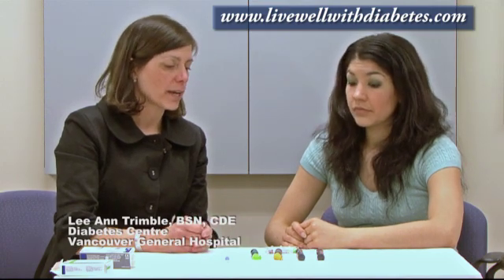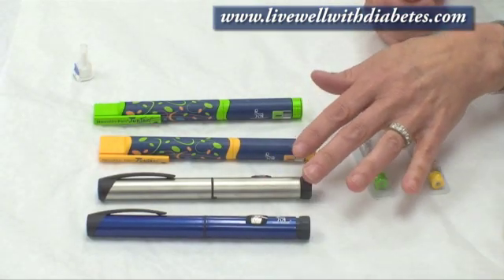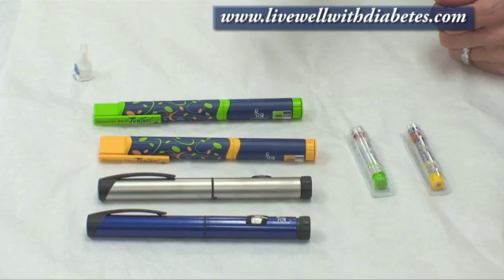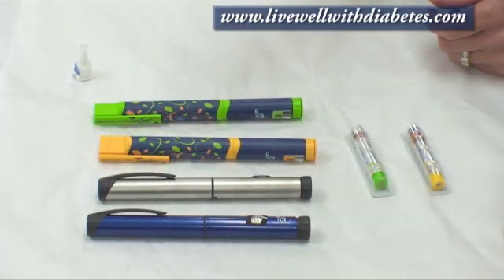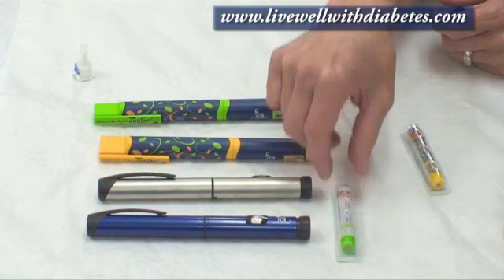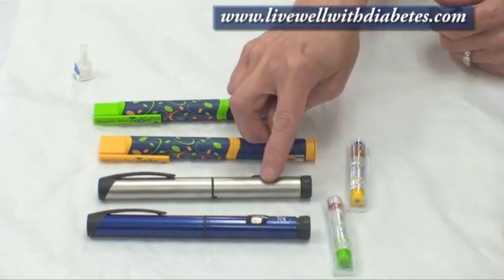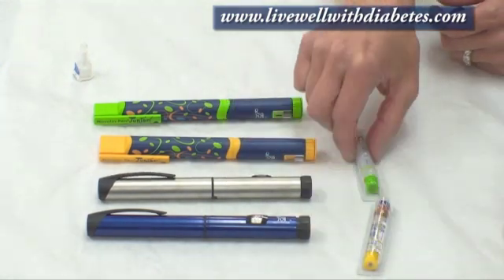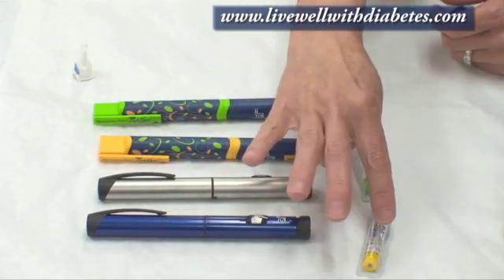Now I'm going to show you the Novolin pen, which comes in different colors. These two are called the Novolin Pen 4 and they differ only by color — the actual mechanics are exactly the same. They're different colors because people take different kinds of insulin; one insulin will be used with one pen and the other insulin with the other pen. They can switch whichever insulin goes in whichever pen they desire.